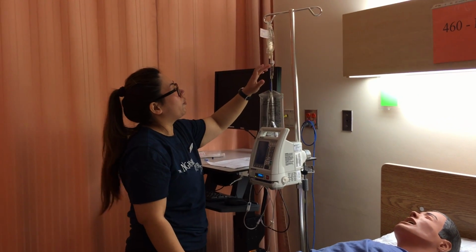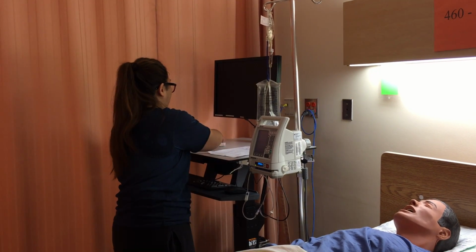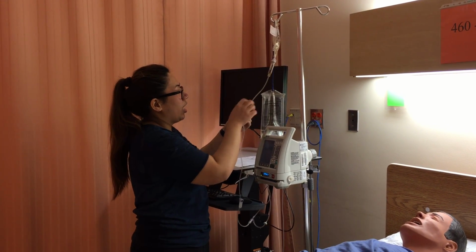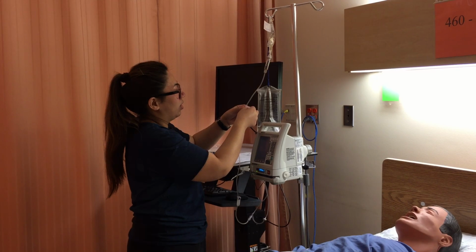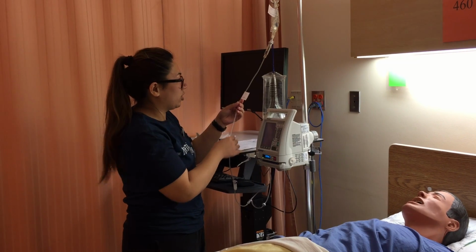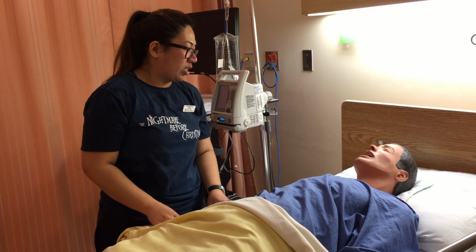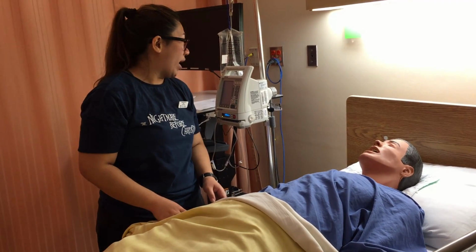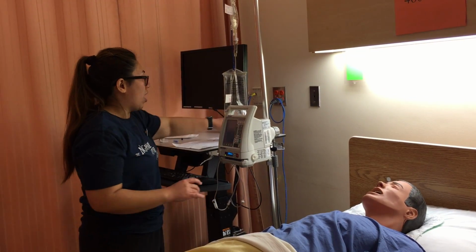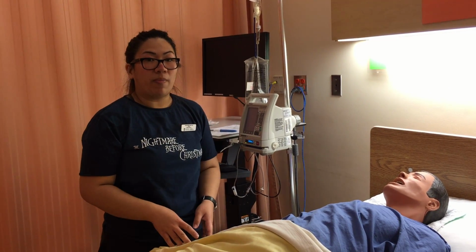I would wait for the first one to three drops, and I saw the first drop. I would also put a label on my secondary tubing to show what time we put the tubing on, and for the next healthcare provider to know when to change this tubing as well. Okay, Mr. Medina, I'm just going to stay here for a few minutes to monitor for any adverse effects. After that, I would document and sign my MAR that I gave the medication, and would also write that in my fluid balance sheet.